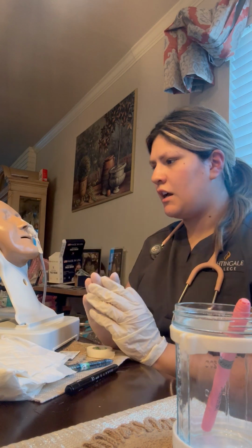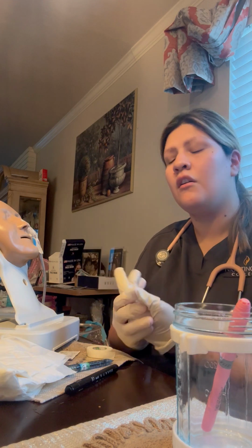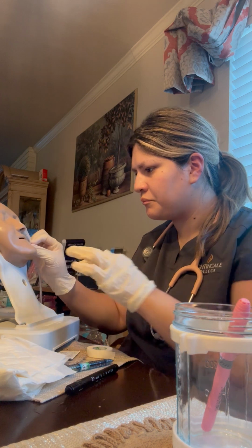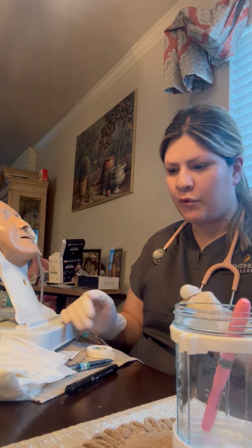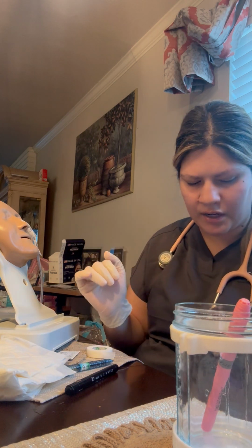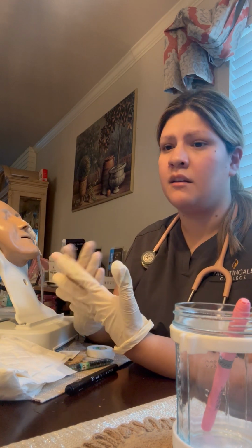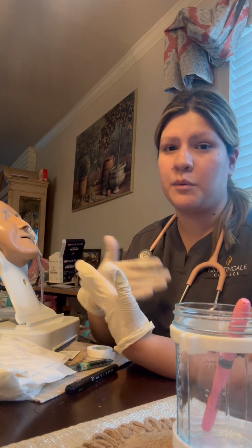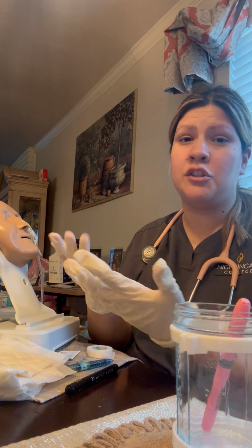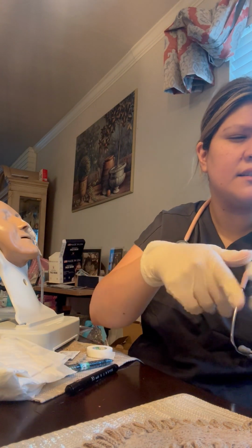And then you're going to ask Mr. Smith, how are you feeling? Are you okay? Making sure that they're okay. So he's okay. I'm going to lower the head of the bed and then lower the bed to a more comfortable position. At this point, x-ray would come in and do an x-ray and verify that the tube is in the correct place, which it should be because we took the gastric contents. We're going to dispose of the gastric contents.